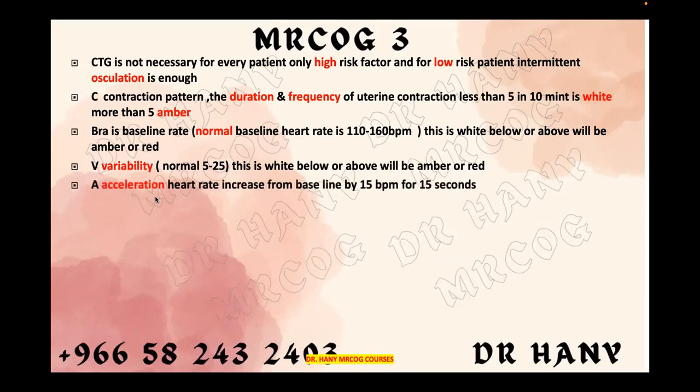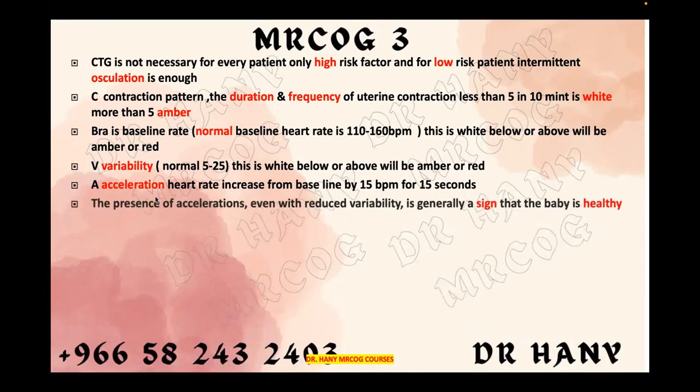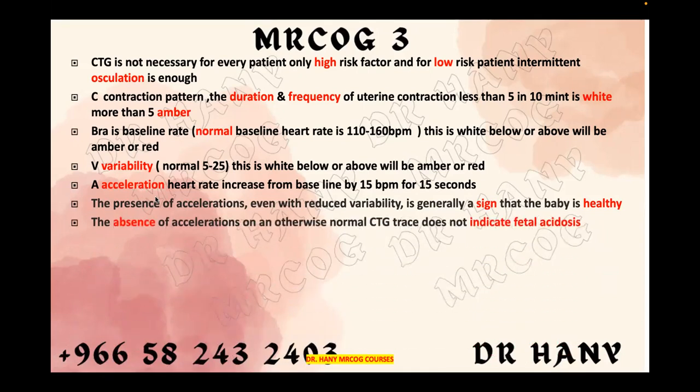The change in variability. Acceleration, you said it's a good reassuring sign or a positive sign. More than 15 beats, over 15 seconds. The presence of acceleration in a reduced variability is a good positive sign that the baby is healthy. But absence does not indicate anything, does not indicate fetal acidosis. That's why it's a positive sign.